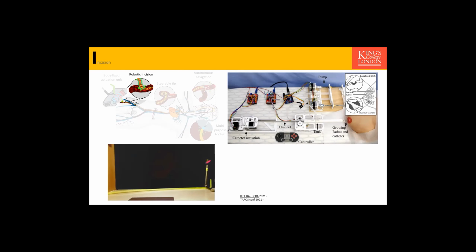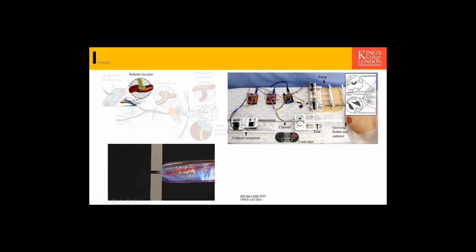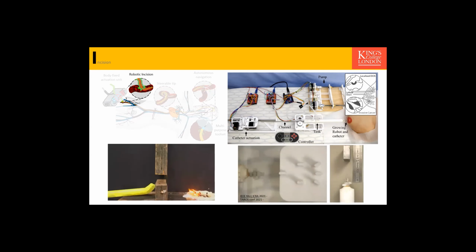We had a postdoc at our lab working on something similar at miniature scale for mammography, and our publication was the first miniature growing robot at the time. What you see here is the tiny growing robot with its steerable catheter at the center, a large fluidic tank to provide the growing pressure, and an active channel to pass through the catheter or the drugs that we want to use during the procedure. This is the robot in action.